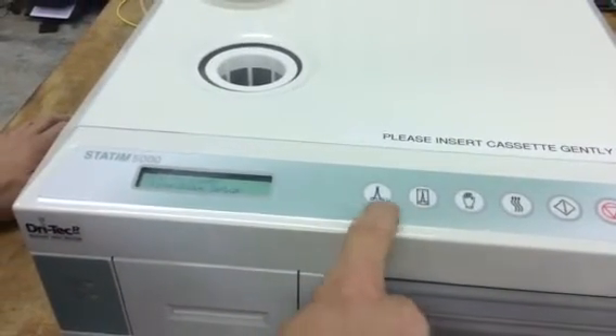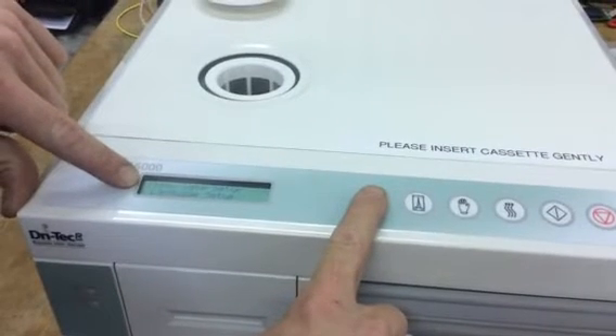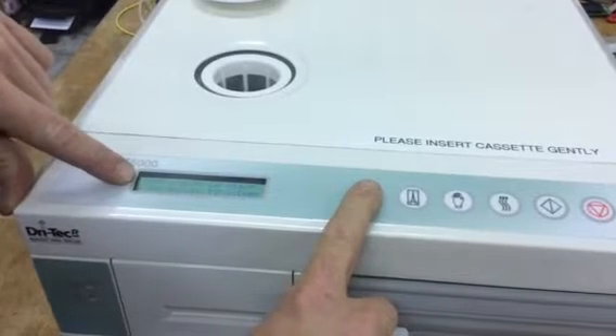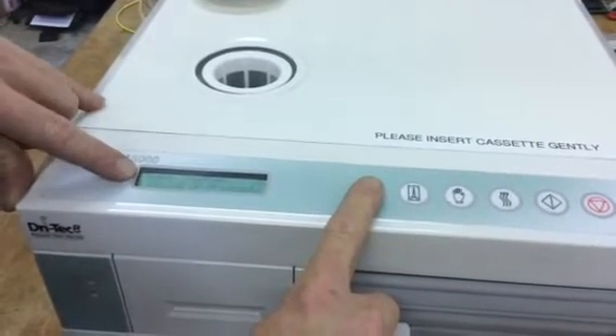Unwrapped and wrapped scroll up and down — there's a little arrow right next to the time. You can adjust the time, the date, the language. Water conductivity setup is another one that you may have to get into.